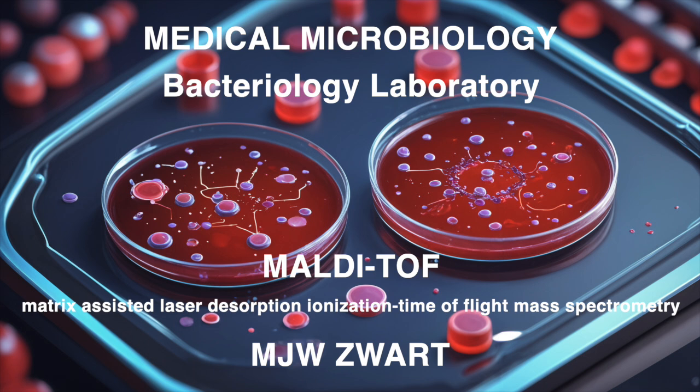Oh, yeah. I've definitely been guilty of skimping on the vortex time in the past. I get it, but in this case, those 2 minutes are crucial. Thorough mixing ensures those HCCA crystals are completely dissolved and evenly distributed. Otherwise, you risk having inconsistencies in your analysis. Ah, so it's all about creating a homogeneous mixture for reliable results. Exactly. You want that matrix solution to be perfect every single time. Now, how long does this matrix solution last once you've prepared it?